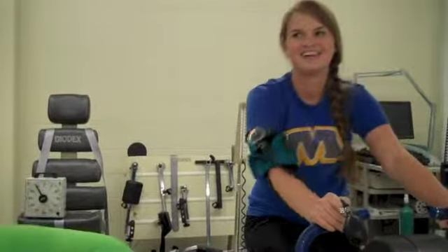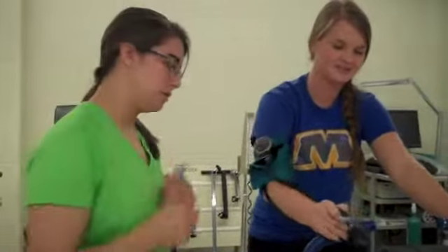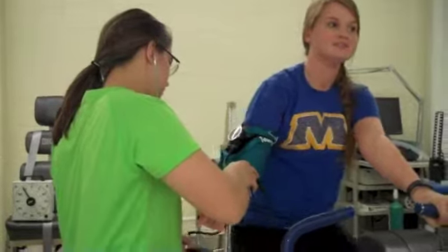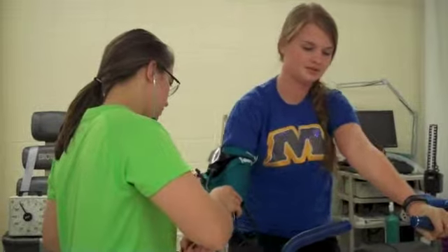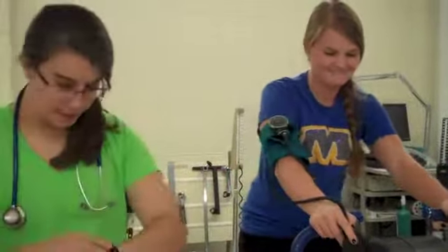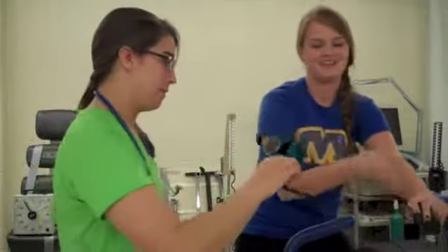Ashley's heart rate was 158. I'll now take a blood pressure. Ashley's blood pressure was 142/86. Little increase there. Since Ashley was so close to her heart rate reserve, I'm going to take another heart rate to see where she's at.